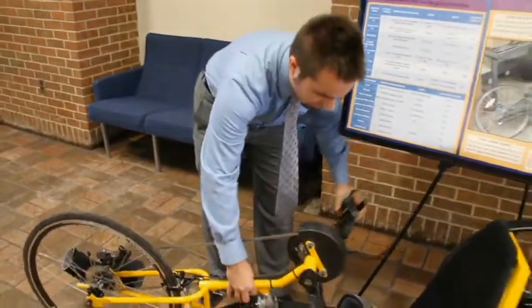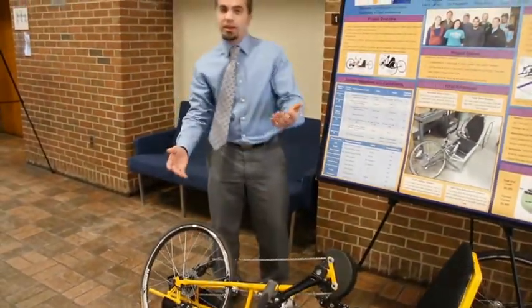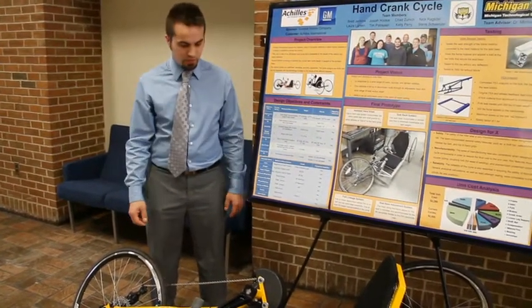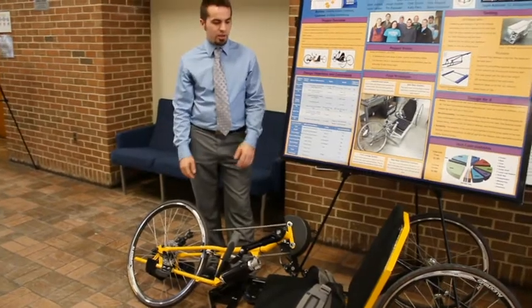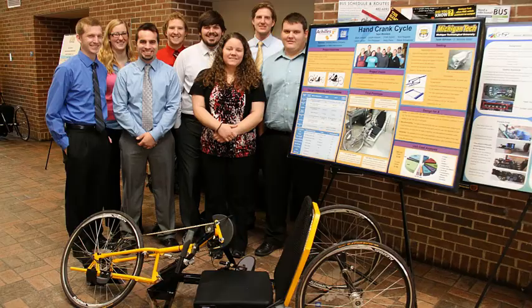More or less just a regular bicycle that is cranked by the hands. This motion here gives you a lot of power. It's easily disassembleable — you just take two bolts out and the fork comes off the frame. You can put it in the back of a Yukon no problem. We're looking to see how many we can fit in the back of a pickup truck — hoping we can fit about eight.